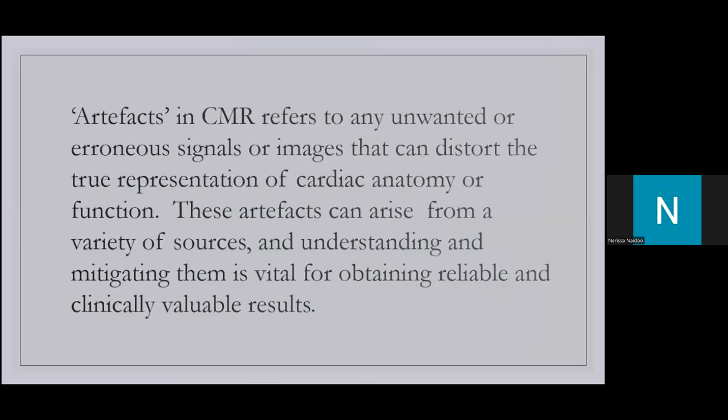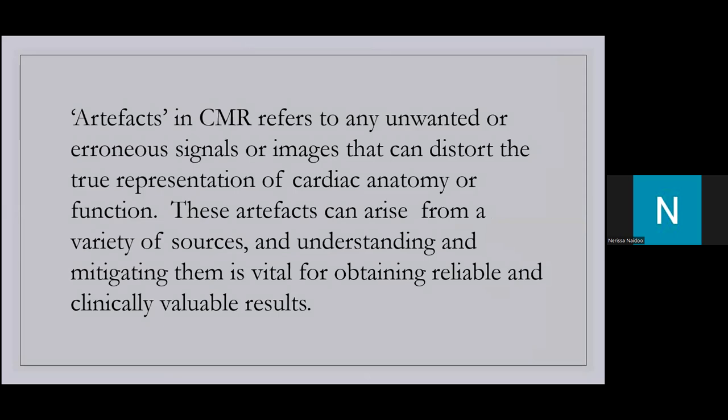What are these artifacts? Basically, artifacts in cardiac MR or any MRI refers to any unwanted or erroneous signals on images that distort the true representation of the cardiac anatomy or function. And we know that these artifacts can arise from a variety of sources. The important thing is to understand them and understand how to remove these artifacts so that we can get a reliable and a clinically valuable result. That is our aim. And so this is what this presentation is aimed to help you with. Can we identify the artifacts? Do we know how to remedy them?